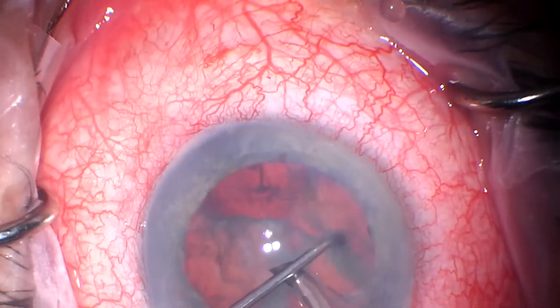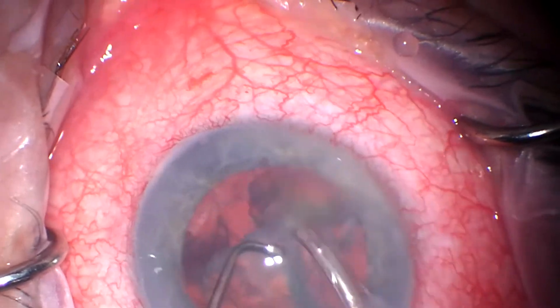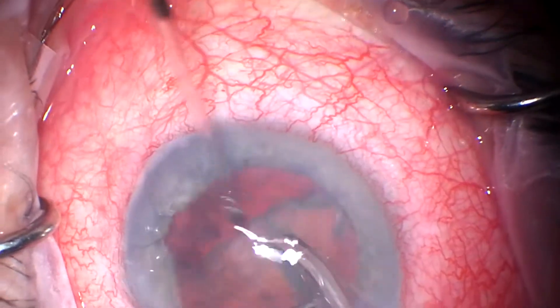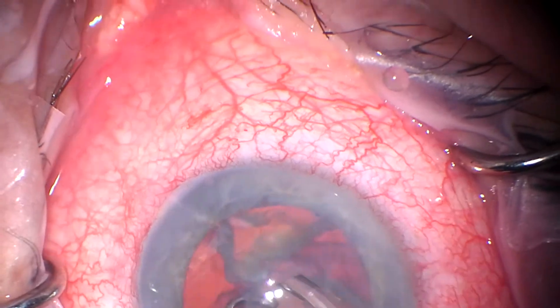I certainly do all the different MIGS procedures when the various ones seem to be most indicated. But I certainly do like the Hydrus.